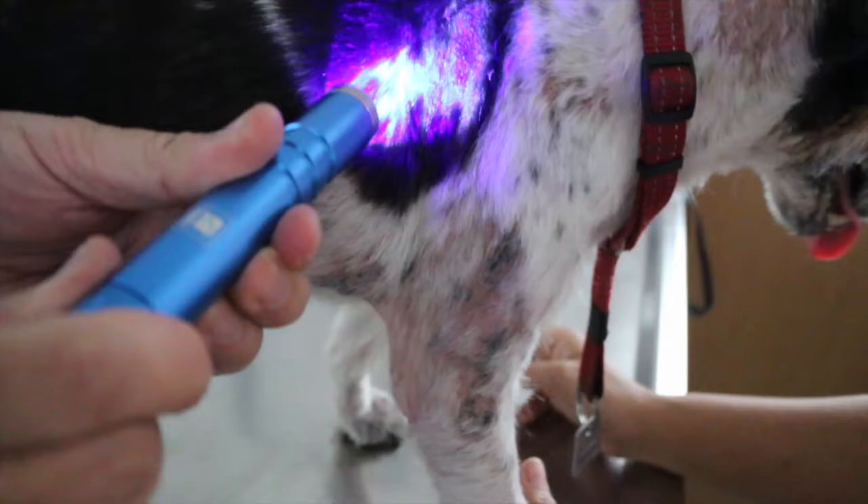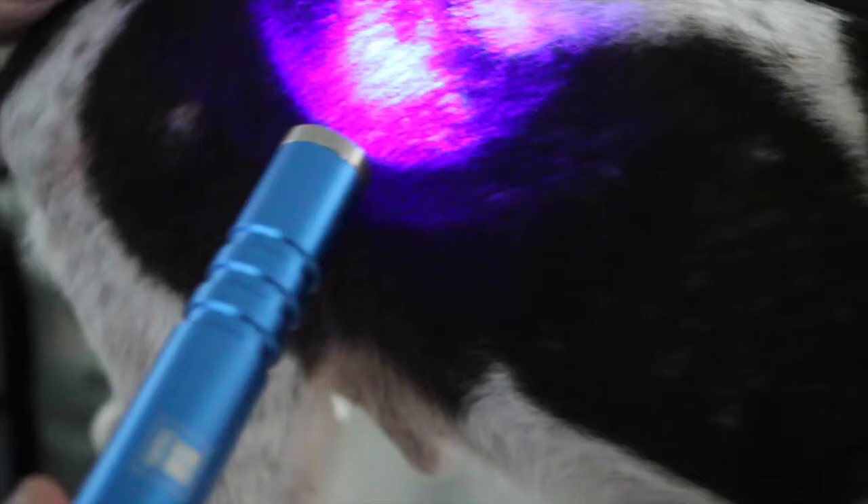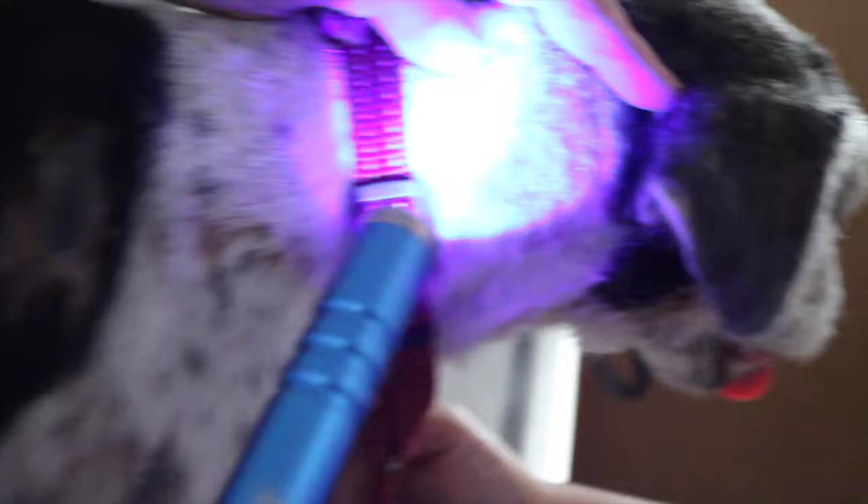Next, let's talk about some tips on filming these scenes. In this example, you can see that the camera focuses on a certain area of the dog to help improve focusing. As the dog is covered in ringworms, we should be able to see some fluorescent areas lighting up. Watch this clip to see how the fluorescent light shines upon an area. Though it's overexposed, the camera is able to focus onto the area, revealing the fluorescent areas that the vet wanted to see.